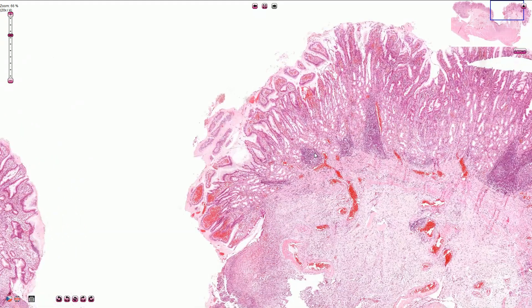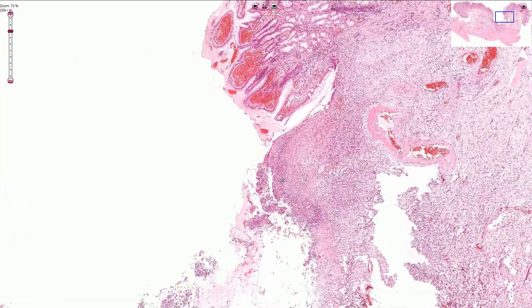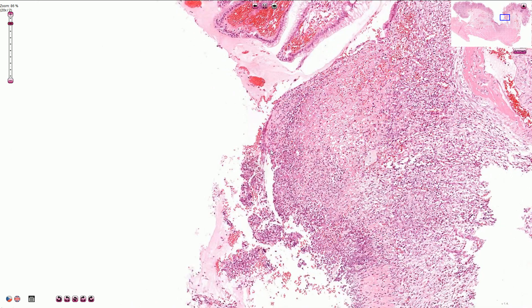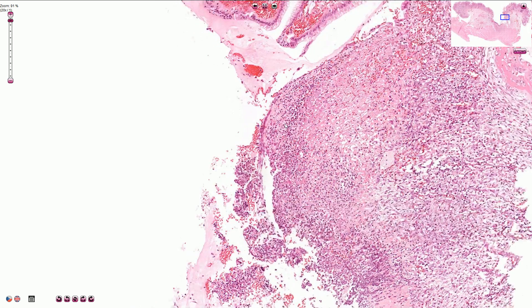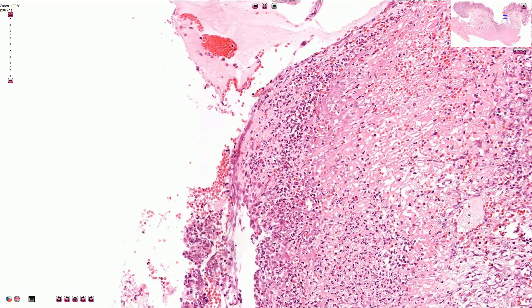At the edge of the ulcer we can see the gastric folds with hyperemia and chronic active inflammation. Going closer, on the surface of the peptic ulcer we can find a fibrinous purulent exudate consisting of fibrin together with dense neutrophilic infiltration — all of these cells with multilobated nuclei are neutrophils.